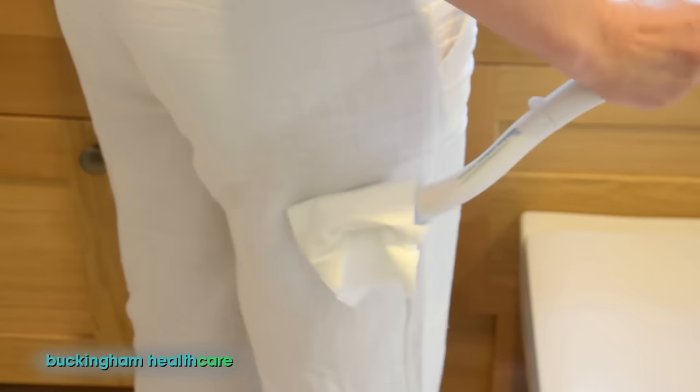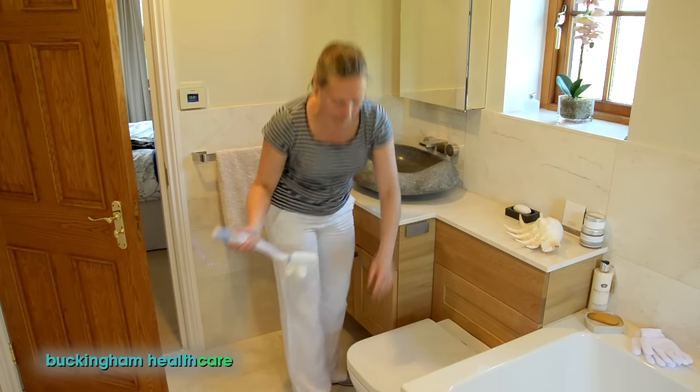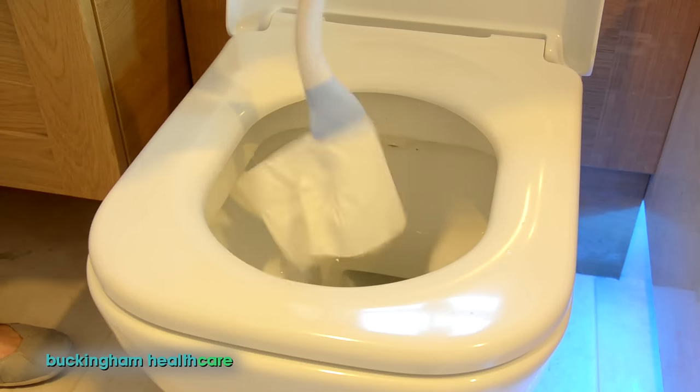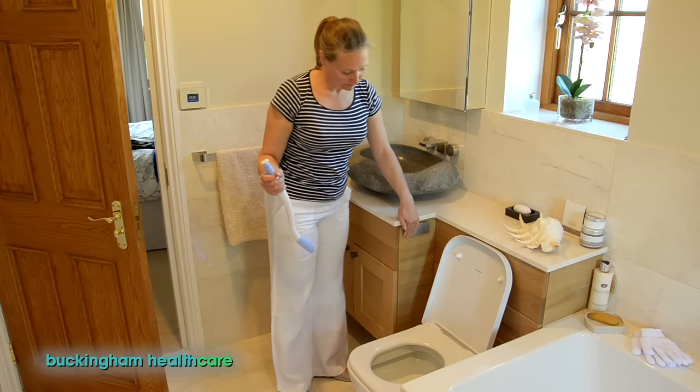The tissue is clamped and held fast until you're ready to dispose of it. Then simply push the button on top of the handle for quick release of the soiled paper, with no need to touch at all.